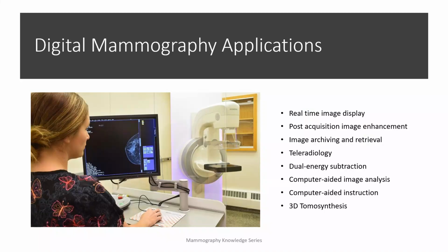Let's review some of the digital mammography applications. We start with real-time image display, then have post-acquisition image enhancement, image archiving and retrieval, and the ability to transmit the images simultaneously to several different monitors, which gives us teleradiology.